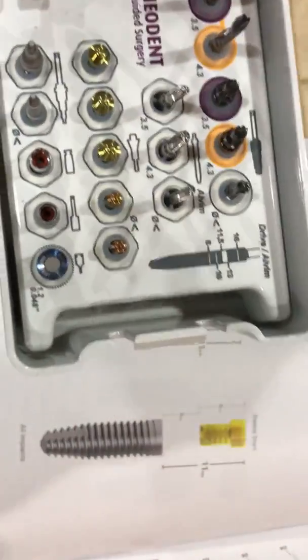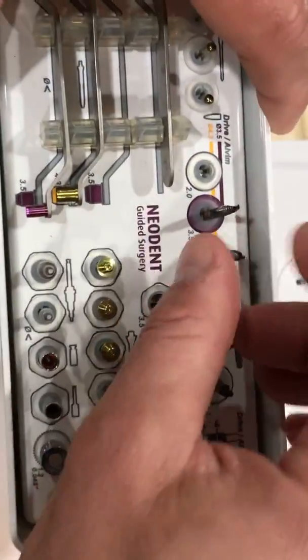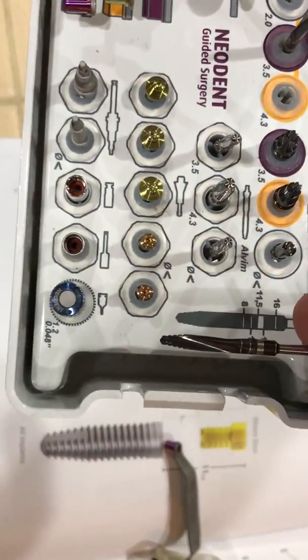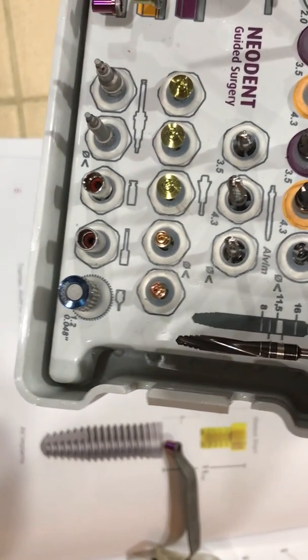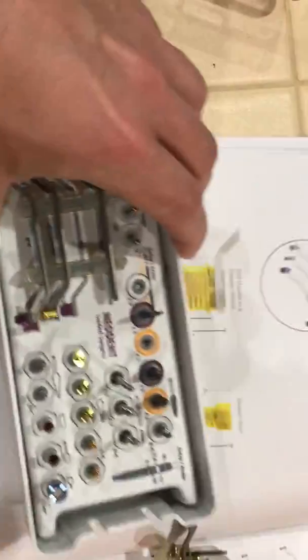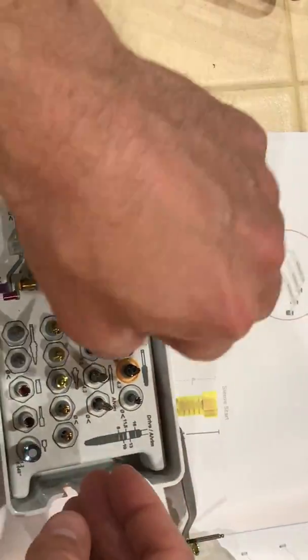The bottom of that silver bar is 11.5 and the top is 13. If we ever forget, we can always go into our kit and put one of our drills up next to the kit. Remember, these drills are all a little bit longer because they're guided — we've got to get them through the sleeve.